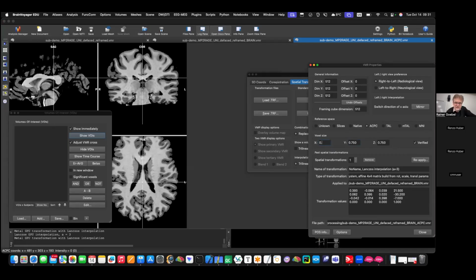This is important. Just do this, 0.3. And then simply save. If you go here on top, there is a save icon. Just click once and save to be sure this is now saved with the new value, 0.3.